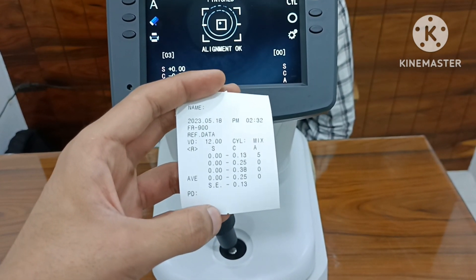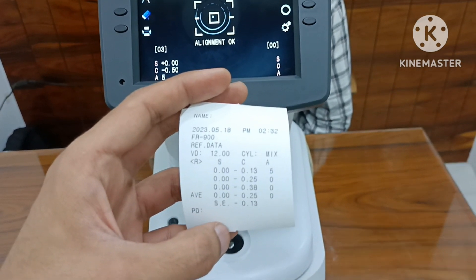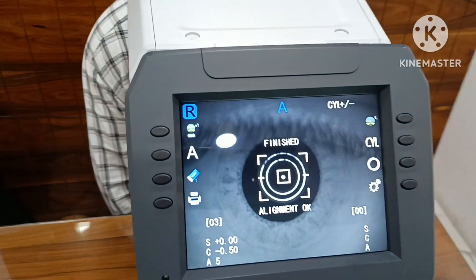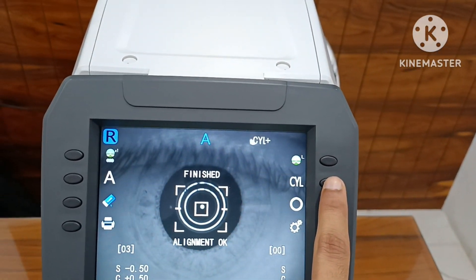Output data includes: PD, Average, SE, NAM, Data, and Cylinder. Cylinder plus and minus available.